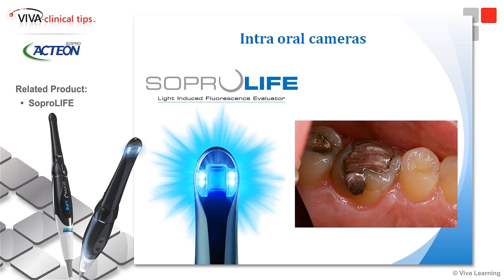And picking up an intraoral camera is so simple. You put the sheath on it, you pick it up with your gloves, you snap the pictures, it takes seconds to do, you put it back in the holder, and it's ready for you the next time you need to pull it out. Especially when you're looking at things like fractures in teeth.